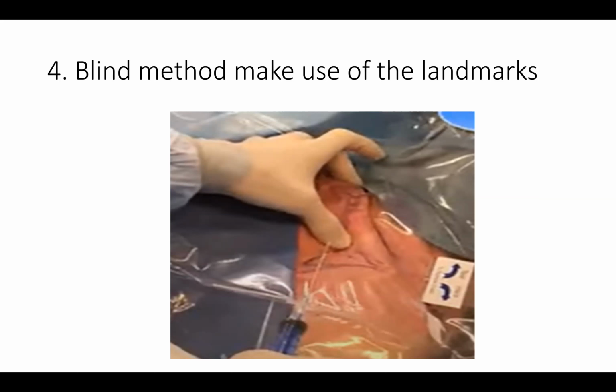When that has been identified, I'm describing this for a beginner, the second thing you will do is put some saline in your syringe and enter under the skin with your puncture needle. Then advance the needle. Just mark that line, advance the needle. That is the key word. Advance the needle to hit the clavicle.